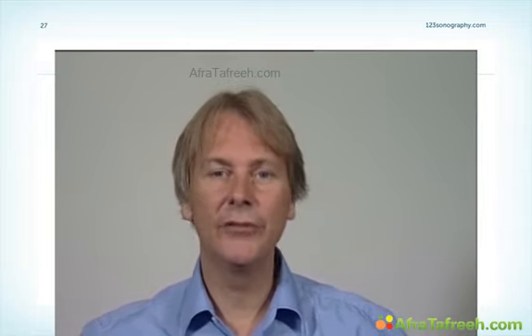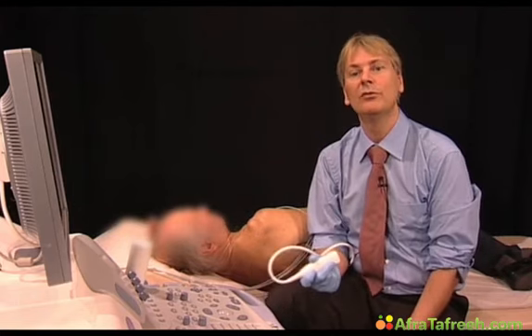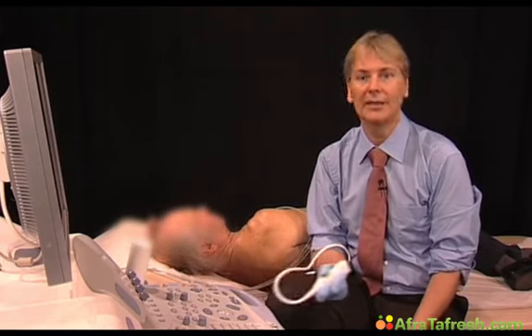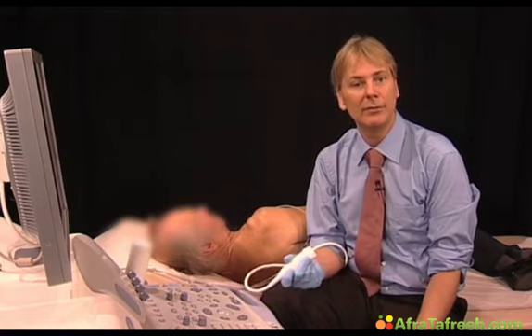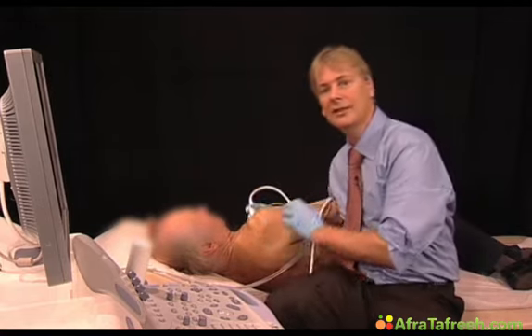Now we'll turn to an inferior infarct. We now have a patient who is 69 years old and in whom we found a scar in the inferior wall, which was found by chance. The patient never had any complaints and he does not remember of having an infarct. But however, on the other hand, the patient is diabetic. So let's take a look at his echo.